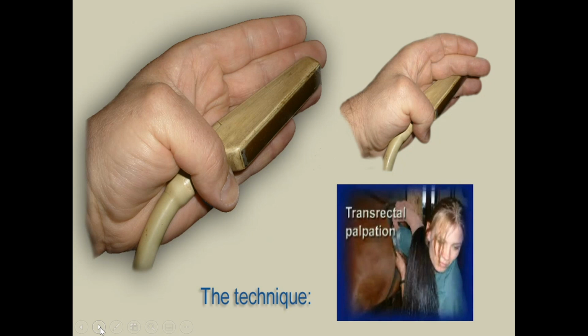You don't want to be pushing the transducer forward without your fingertips in front of it, because your fingertips are what are sensitive, and that will allow you to know if the transducer is able to move freely or not. Modern transducers are actually a pretty similar size to this one, so they should fit neatly in the palm of most people's hands. And it's always a good idea to have your fingertips slightly ahead of the transducer face.